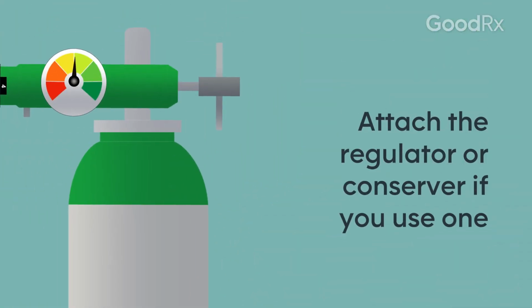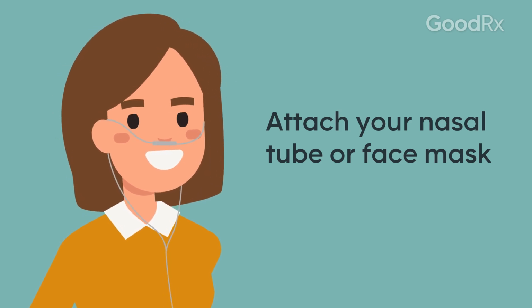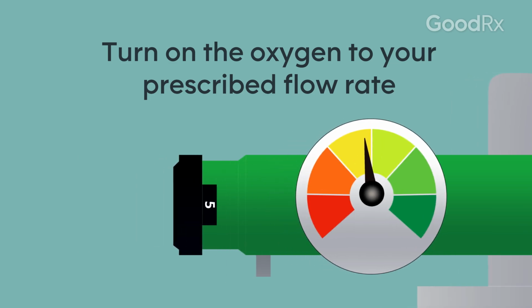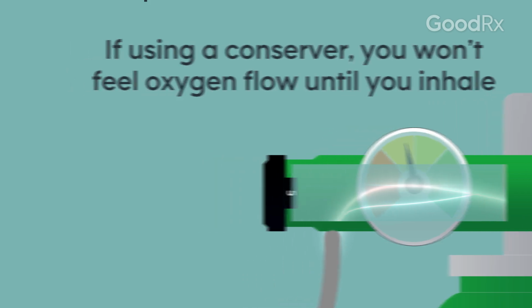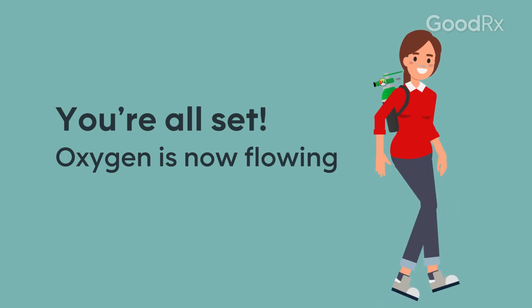Attach the regulator or conserver if you use one. Attach your nasal tube or face mask. Turn on the oxygen to your prescribed flow rate. If using a conserver, you won't feel oxygen flow until you inhale. You're all set. Oxygen is now flowing.